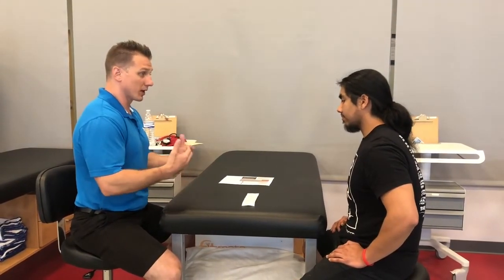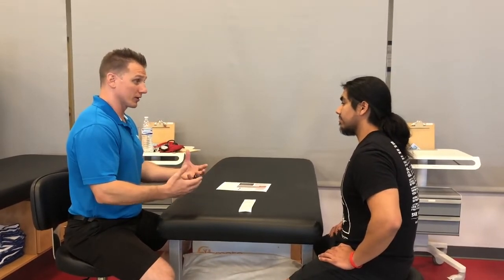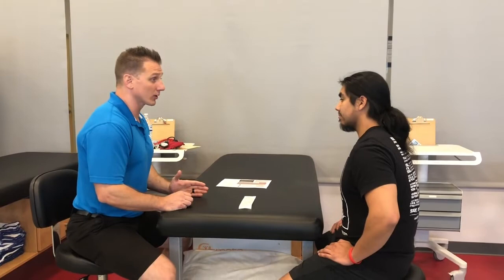Over a course of months, that number's going to come up, which is what we'd like to see. A normal body fat percentage for an individual like yourself is somewhere between 15% and 25% for males, and that is considered heart healthy. Depending on your goals, we may look at adjusting that body fat percentage — since you said you wanted to lose some weight earlier, we will use this information to see if you've improved, stayed the same, or have gone the other direction.